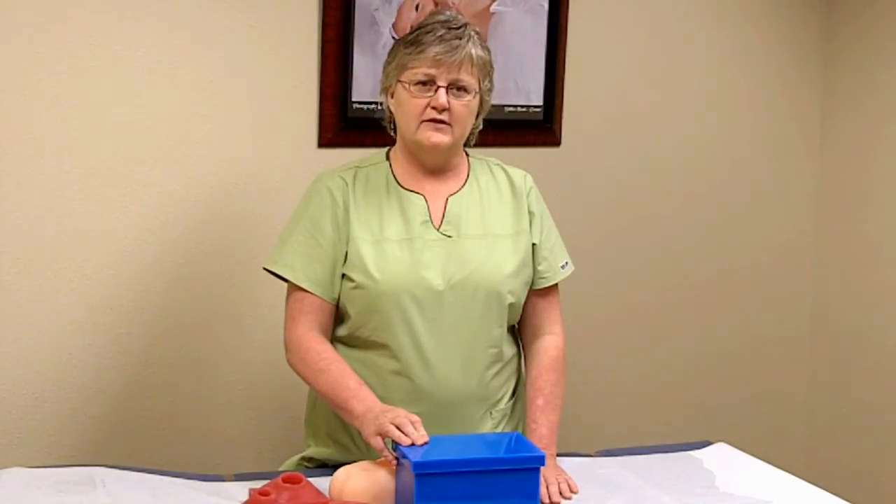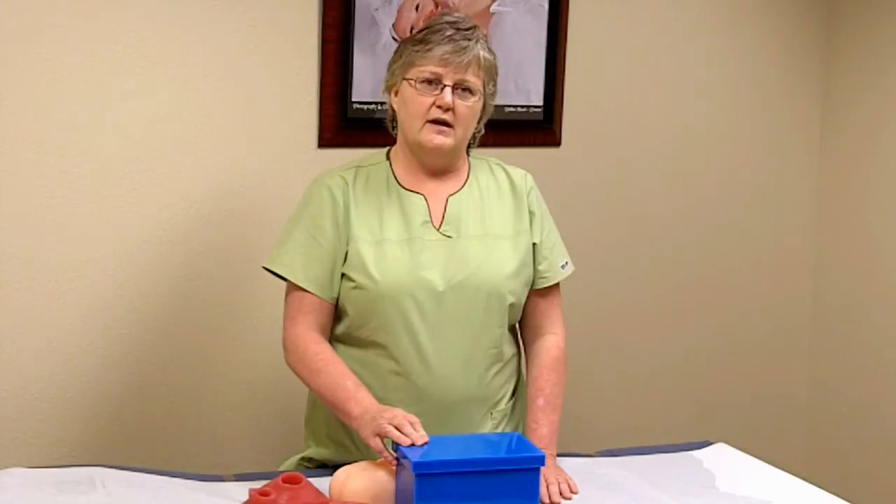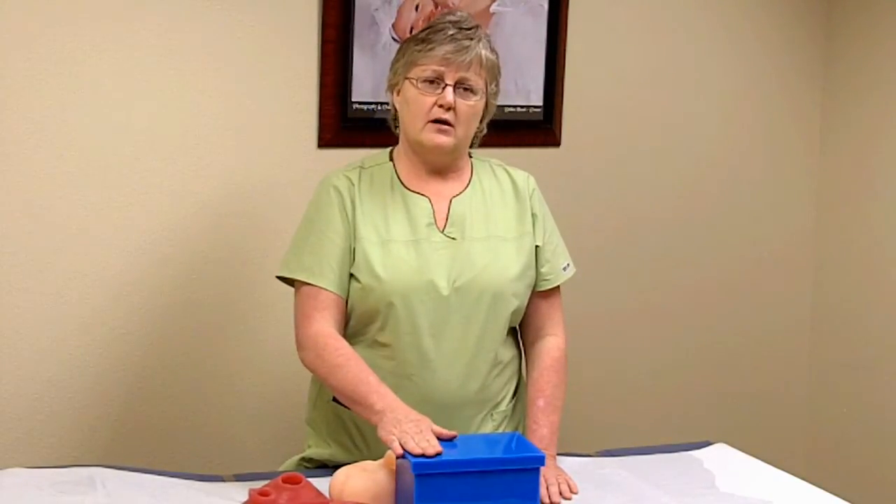I'm Christy Miller. I'm a certified nurse midwife on the Childbirth Graphics Advisory Board. I'm going to teach how to use this cervical exam model.